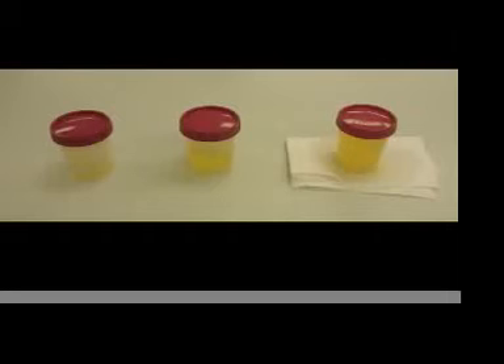On the left in this photo, the cup is not full enough. On the right, the cup is too full. The cup in the middle shows the appropriate amount of urine to collect.